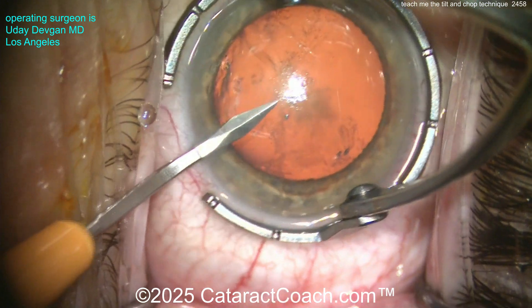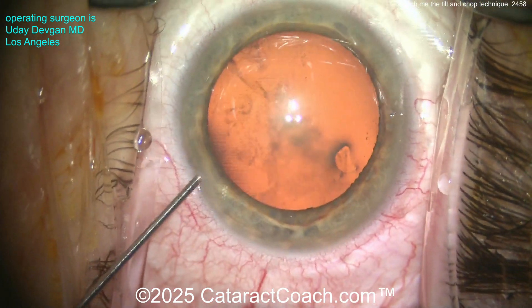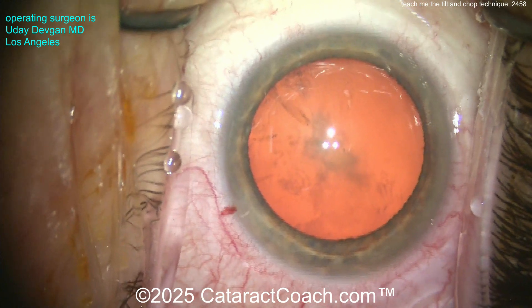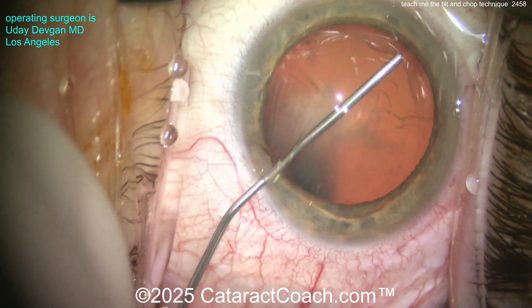Starting off with the prep — let's check out the draping. Good thing Cataract Coach did a reasonable job with the draping. Here comes some anesthetic: a little bit of preservative-free lidocaine along with some phenylephrine going inside the anterior chamber. This patient has topical anesthesia, no block of any kind.